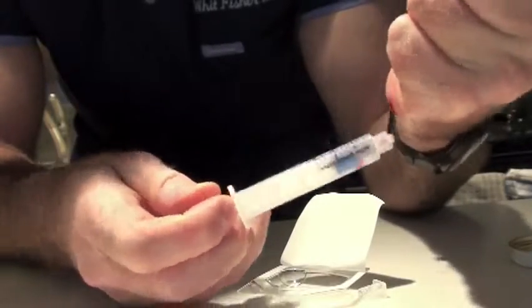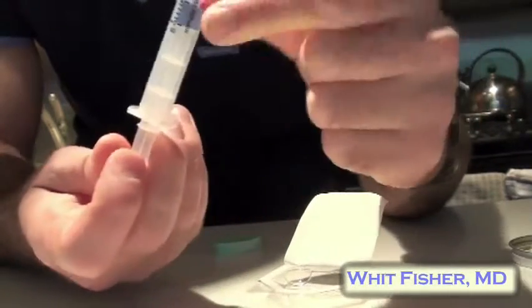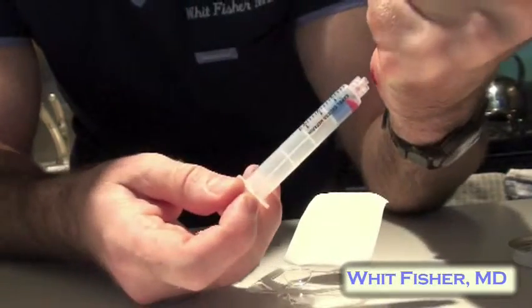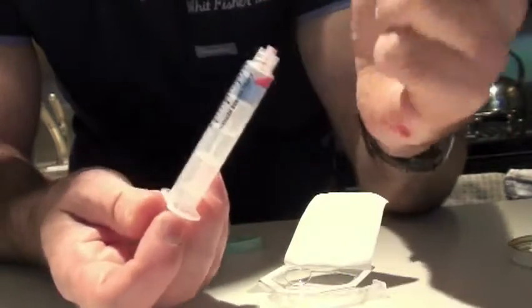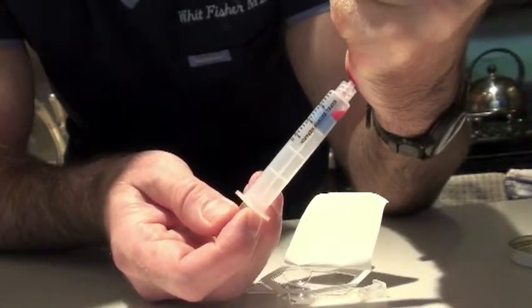Then what you do is aspirate each little drop of blood into the heparinized syringe. Push the extra air out and then aspirate the next drop. Keep going over and over until you have about one cc of blood.